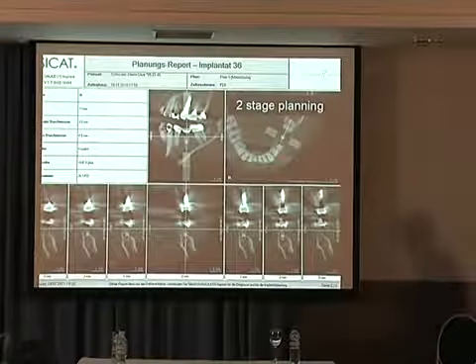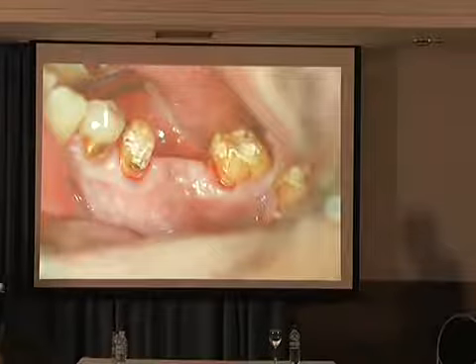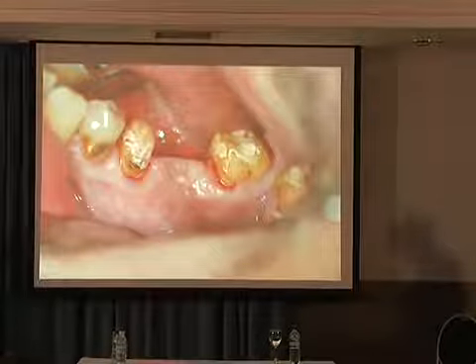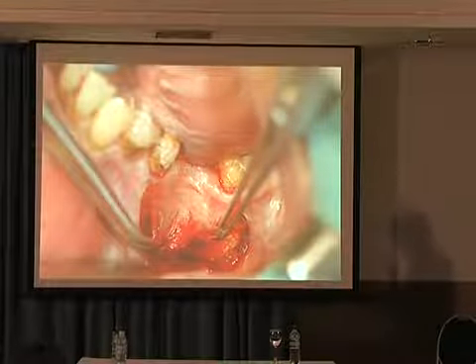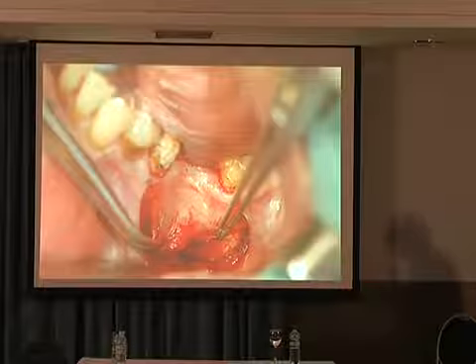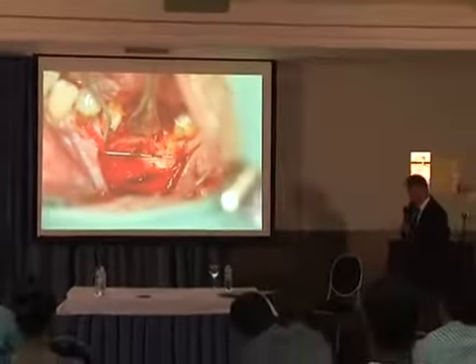Treatment planning, 2-stage bone block transplantation. The same again, vestibuloplasty, split flap. Again the same technology. We remove only the vestibular mucosa. You get an idea about the defect.